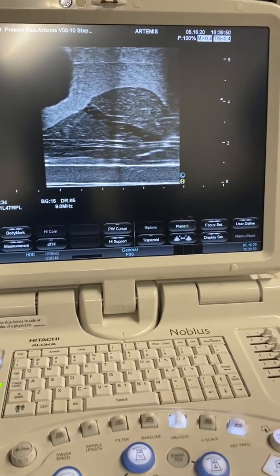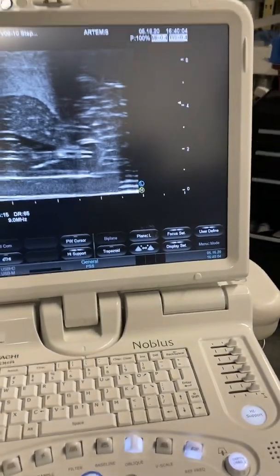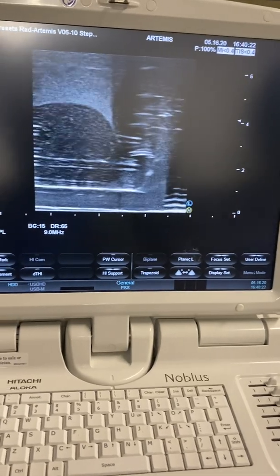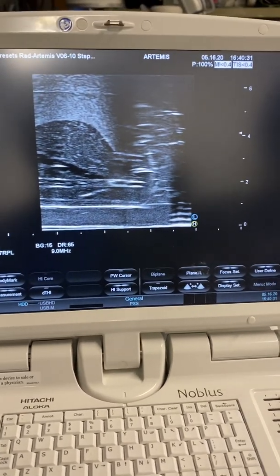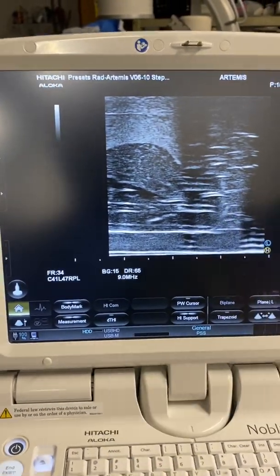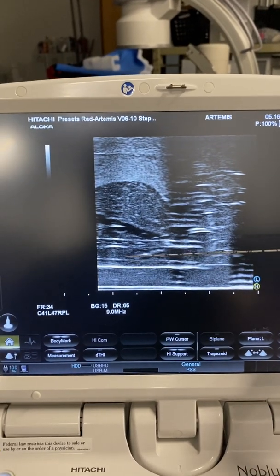They'll have you start on sagittal. They're going to step out to the perineum - the perineum is over here at the apex of the patient. They want to see the needle coming in, about a centimeter or a centimeter and a half above the probe, going midline. If they don't see the needle, they can turn the probe to visualize it. They'll follow the needle in and aim for that mid-gland, midline area, threading the needle down below the apex into the mid-gland.